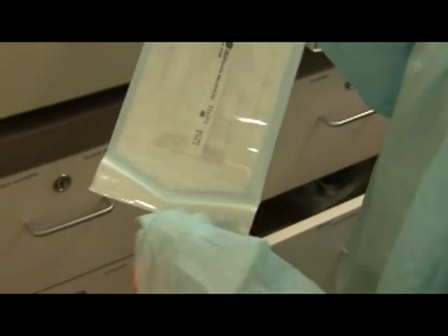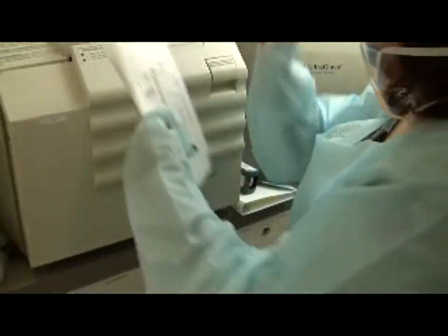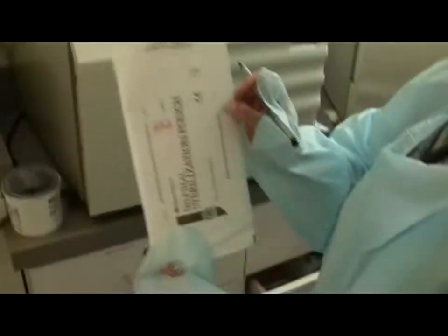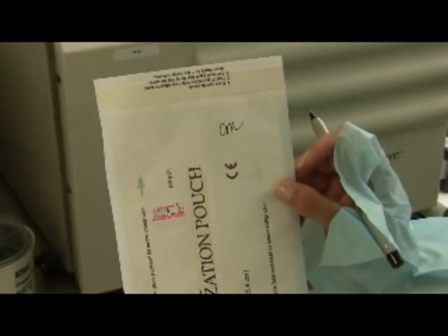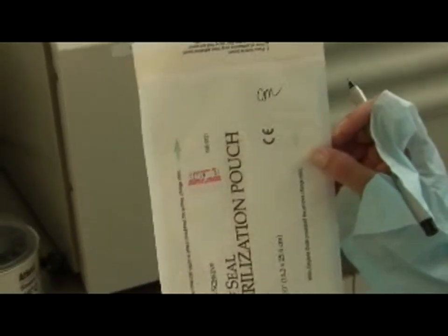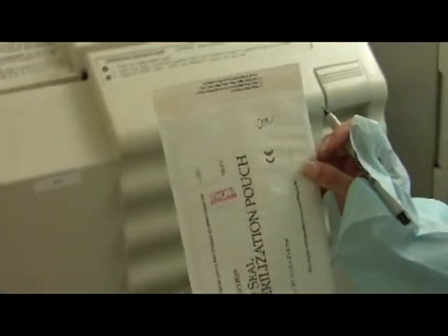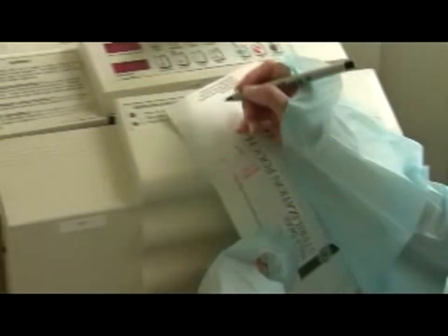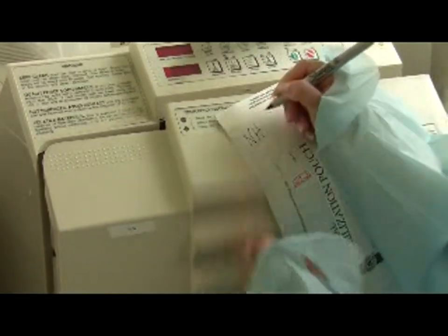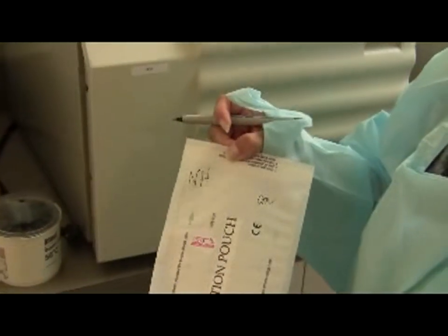Initial each pouch with the cleaning person's initials. The pouch containing tooth forceps must be labeled 'T', the pouch containing serrated forceps labeled 'S' with a Sharpie marker. For curettes, write the curette number on the pouch. For needle holders, write 'NH' on the pouch.